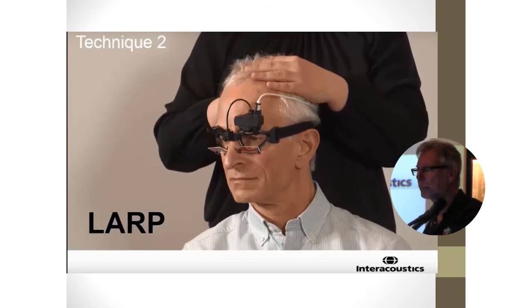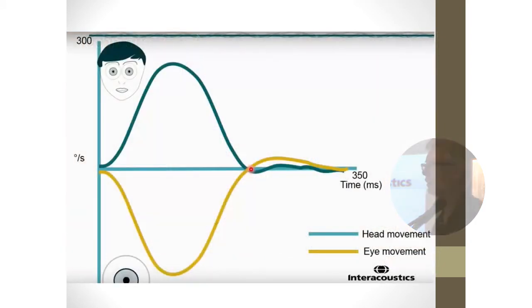And so once you develop the ability to do these, then this is a quick and easy test, and it's very comprehensive because we're talking about all six canals rather than one canal, right? And that's what you would do when you did a caloric test, just a lateral canal. And all of these things are in the attempt to be more sensitive to actually finding pathology, rather than having the patient come back with no findings though they still have legitimate symptoms.